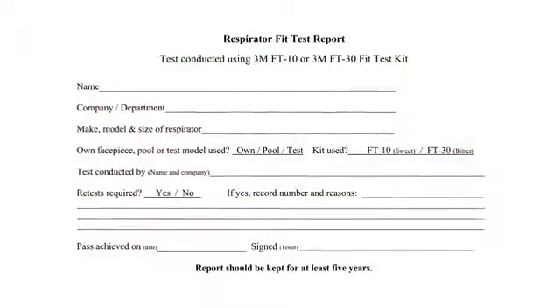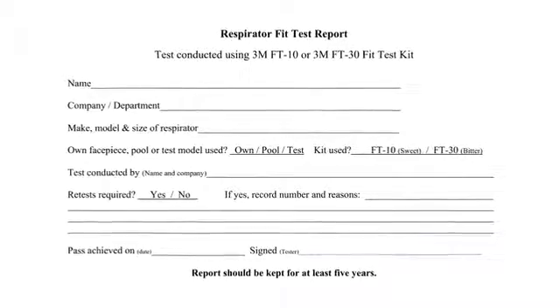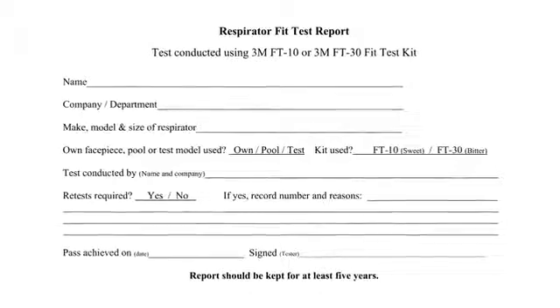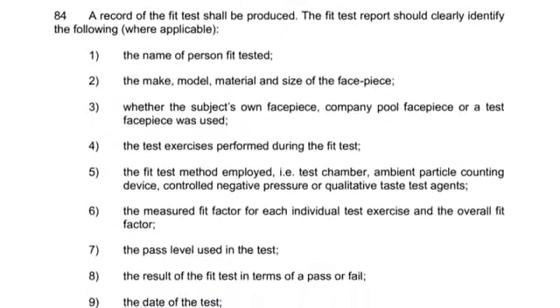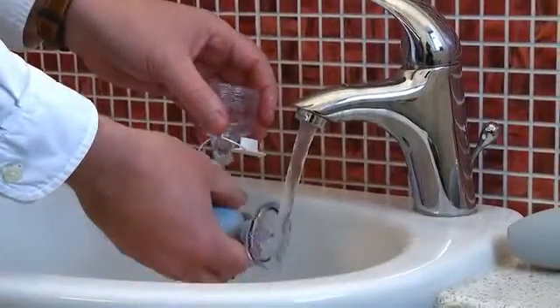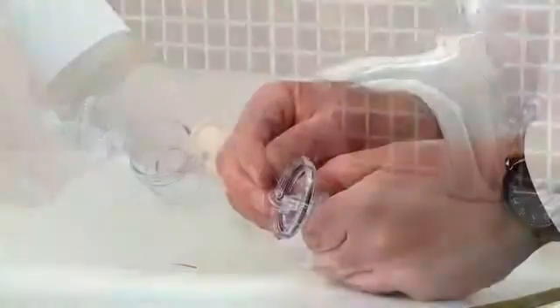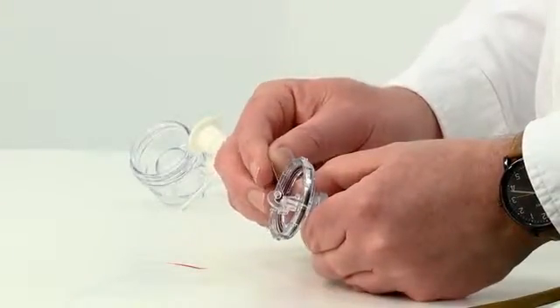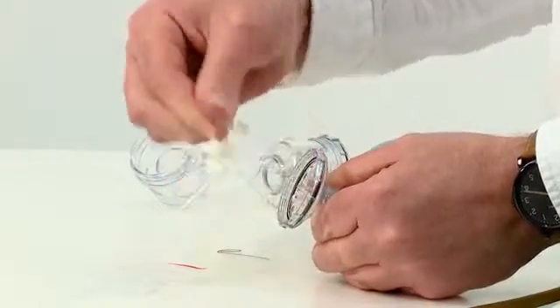After the test, a record should be created. Use the 3M record sheet available on our website or create your own. Details of the content of a record can also be found in the HSE's information document. The nebulisers should be thoroughly rinsed out after use and wiped dry. If the nebuliser becomes blocked, it can be cleaned with the pin provided or the jet can be replaced.